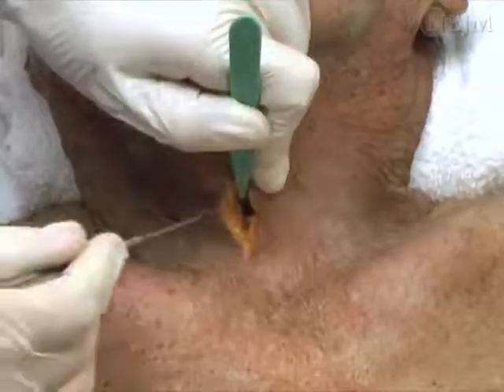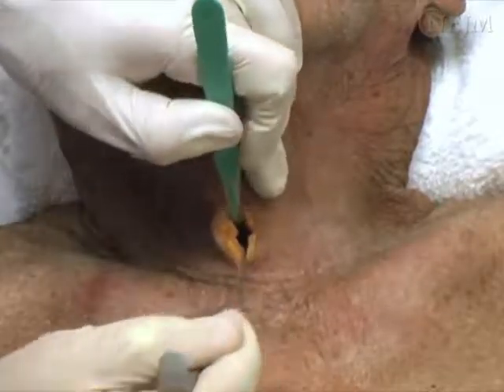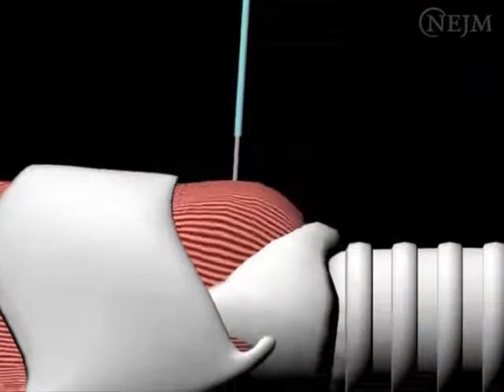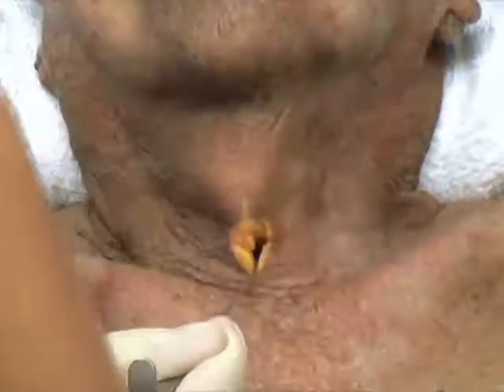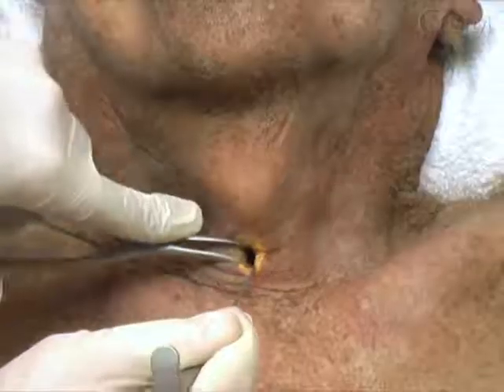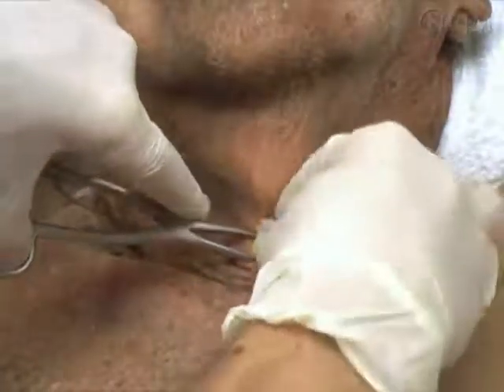Insert a tracheal hook and pull upwards on the distal portion of the incision, elevating the larynx. Once the tracheal hook is in place, you may remove the blade. Insert a trousseau dilator and open the membrane vertically. Then insert the tracheostomy tube.